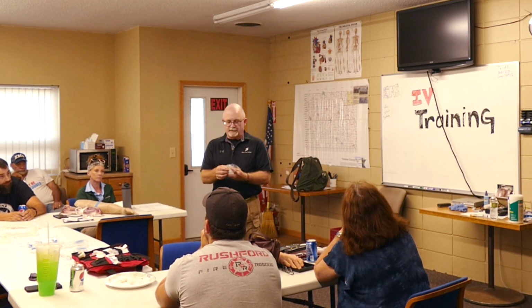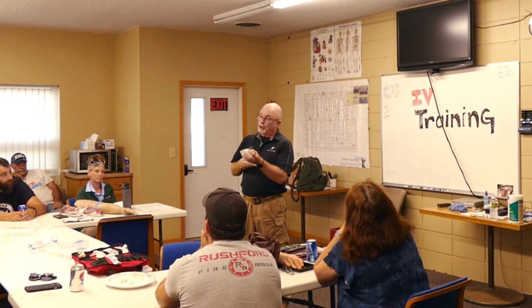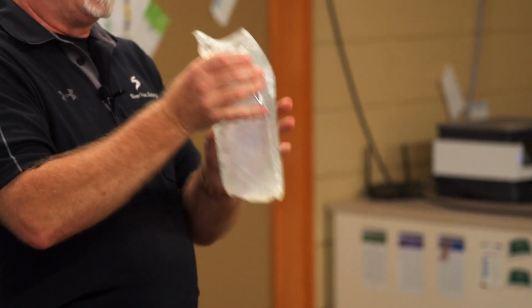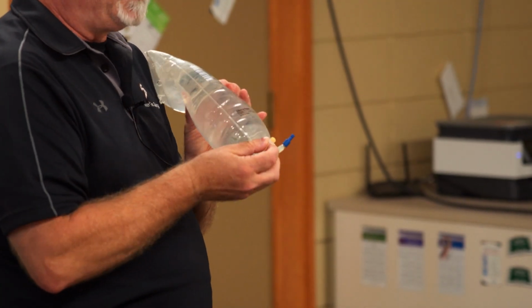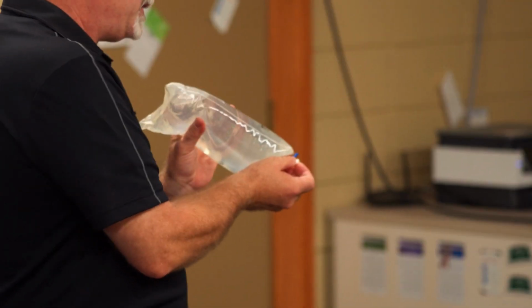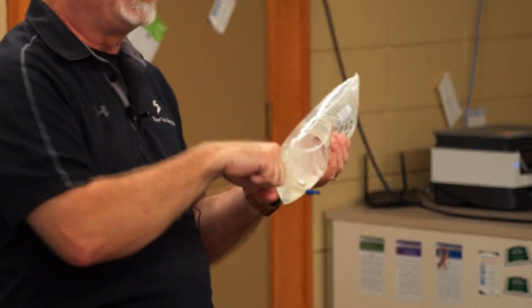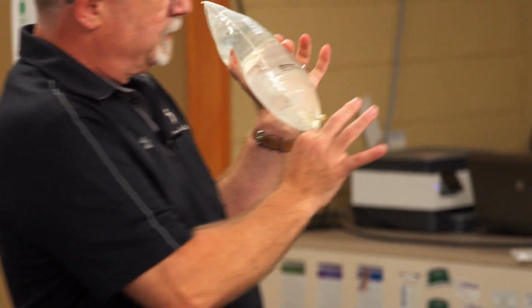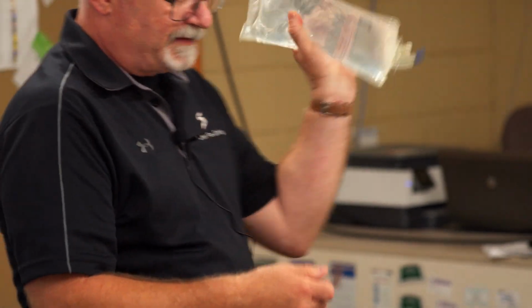The other parts of this: this here is called a medication port. One could add medication to this solution to create a drip of some sort. We could add potassium, epinephrine, whatever we want. That's generally what this is used for. Especially early on, if you're not terribly familiar with these, you're going to try to puncture that one instead of this one, and you'll go, what the heck, this big thing isn't going to fit into that thing, and suddenly water's flying everywhere. The blue one is where you actually put in your drip set. We'll pull that off in just a second.